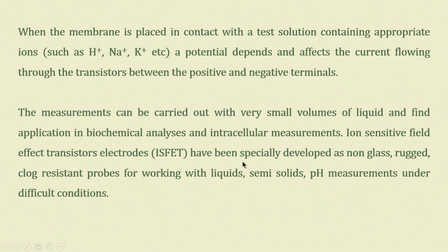And ion sensitive field effect transistors are known as ISFET. Ion sensitive field effect transistor electrodes have been specially developed for such purposes. They have been developed as non-glass, because we do not want foreign material inserted which is not compatible with our blood, tissues, etc. It should preferably be non-glass, because if the glass breaks, there will be glass pieces inside the body which can cause problems, and they should be rugged and clog resistant.